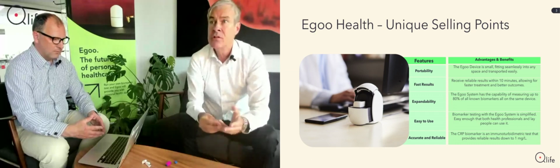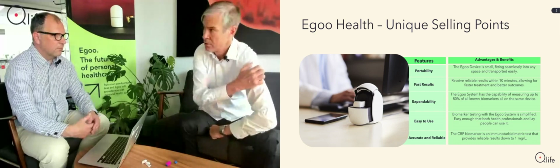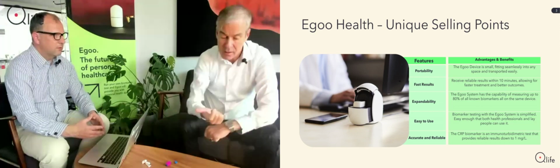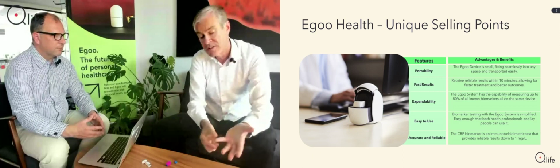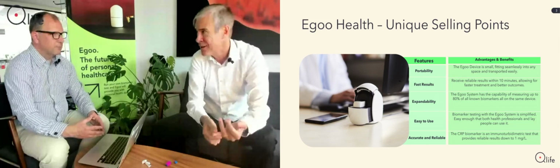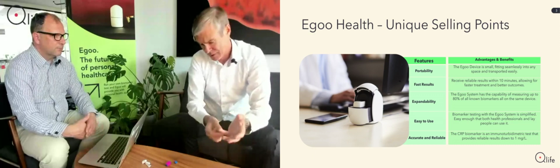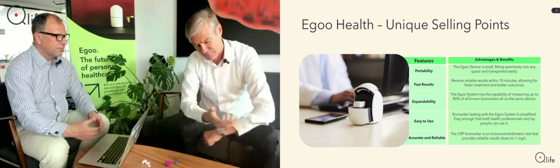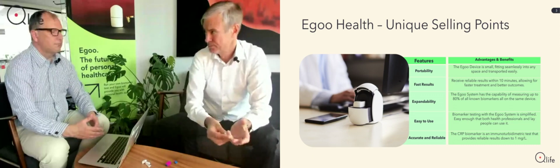And in that relation, I can also mention that there are devices now where you can put them on your shoulder, and they collect the blood. The reason for that is really to avoid the small stick in your finger, which is a little unpleasant. So if you don't like to get that pain, there are these. We have not developed so that it fits to that, but that's something we could do in the future.